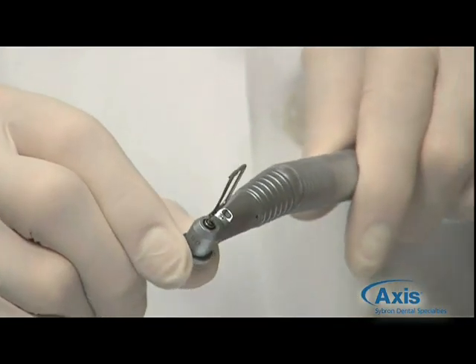between the two teeth. Once I've produced the amount of interproximal space that I desire, in this case 0.2 of a millimeter, I carefully record that on a sheet so that I know how much I've done and still how much I have to go in the subsequent visits.